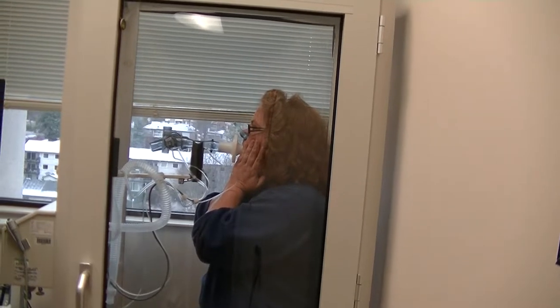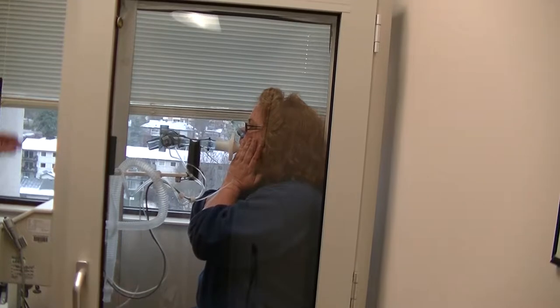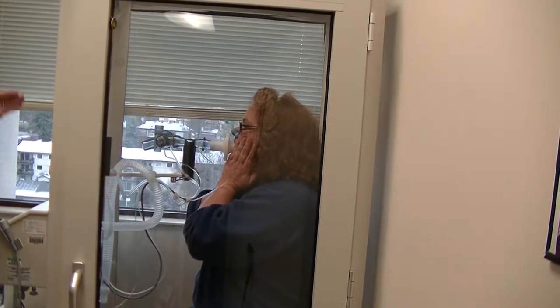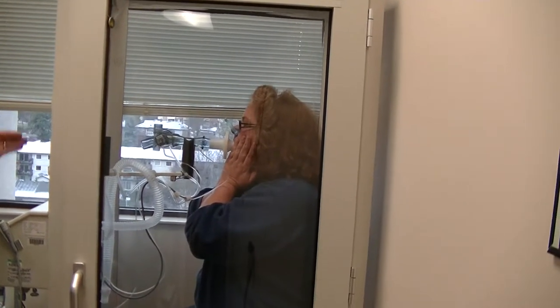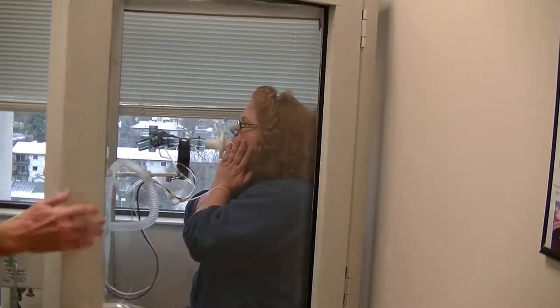When I say pant, I want you to follow my hand. Little tiny baby pants. And pant for me — in and out, in and out, in and out. Perfect. Keep going, in and out, in and out, in and out, in and out. Great job.